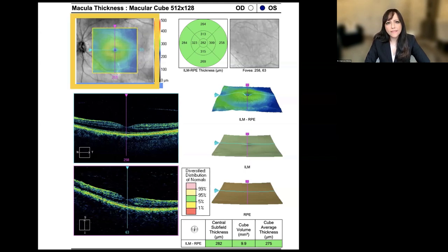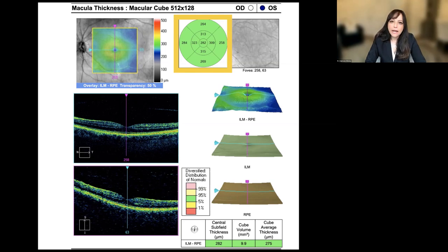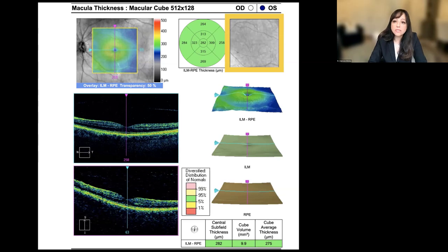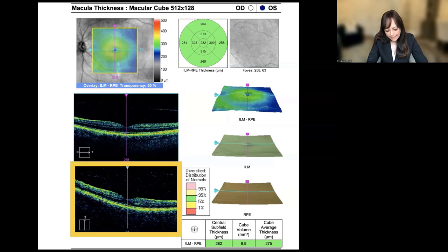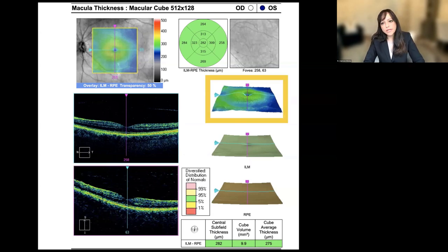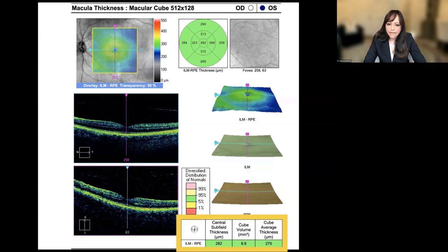Let's get familiar with this analysis report. We have the laser scanning ophthalmoscope (LSO) fundus image with the ILM-RPE retinal thickness map overlay. This is the ETDRS grid, which is compared to normative data. We have the OCT fundus image showing cross-sections through the horizontal and vertical crosshair lines, plus the 3D macular thickness map, the ILM map, and the RPE map, along with macular parameters.